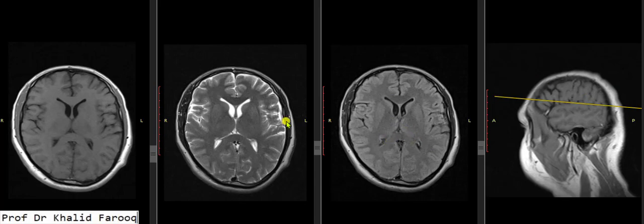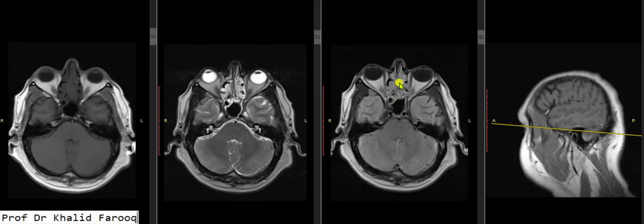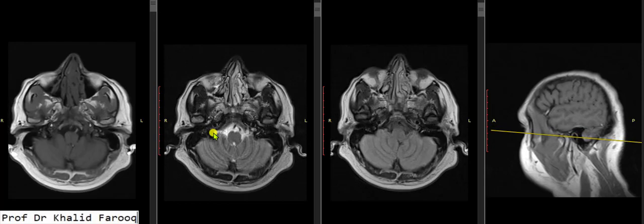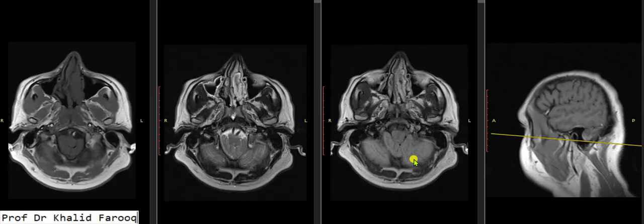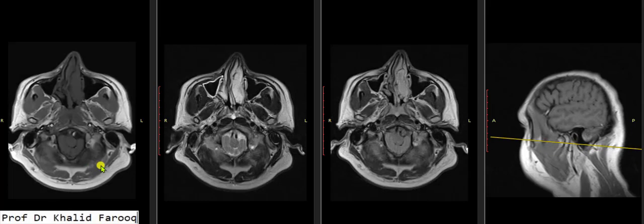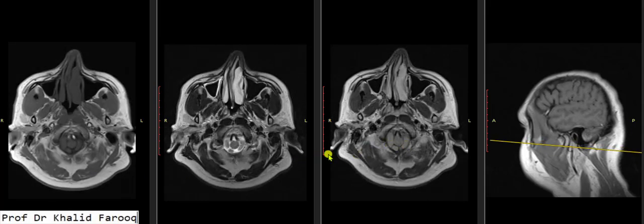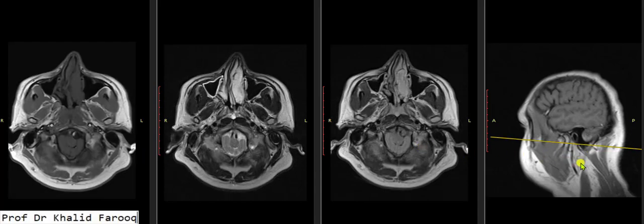Inflammatory changes are noted in the ethmoid air cells. Eyeballs and extraocular muscles are normal. When we go down to the region of the foramen magnum, we see that cerebellar tonsils are noted in the foramen magnum. Let's see the sagittal images.